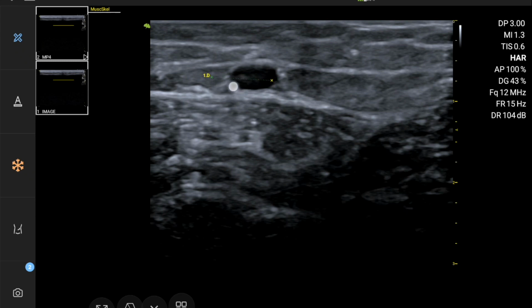So if I wanted to measure the distance, for example, from one side of this vessel to the other, I just use the touchscreen, and even once I've already put the marker in its place, I can still move it, again, just using the touchscreen and moving these little points around with my finger. If I want to clear that measurement, I can use this cross down the bottom here, and that should clear the measurement for me.